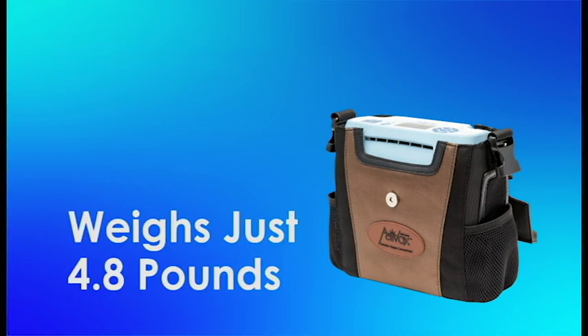It's going to weigh a little bit heavier than the last model, the last model weighing at 4.3 pounds. This is going to weigh just 4.8 pounds, so about a half a pound heavier.